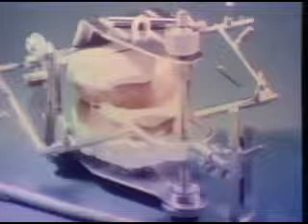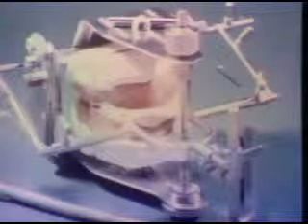This rather simple combined face bow central bearing point registration technique, here in a setup for complete denture construction, was designed: 1. To determine centric jaw relation, 2. To trace and measure the condylar path in protrusive movements, and 3. To transfer the data on an articulator.